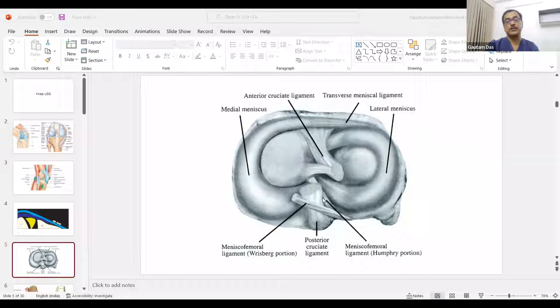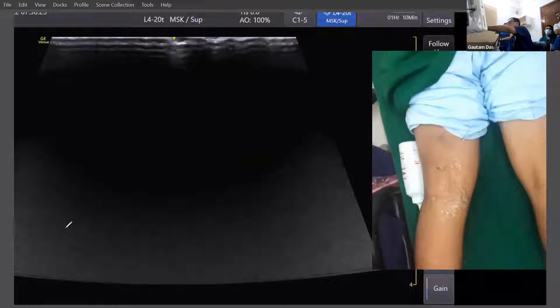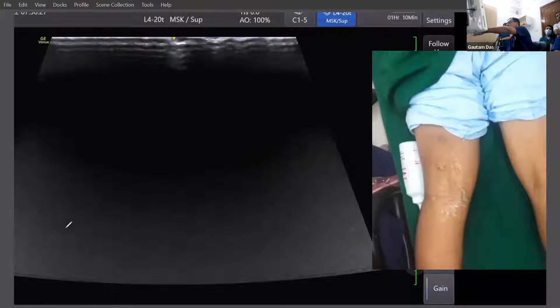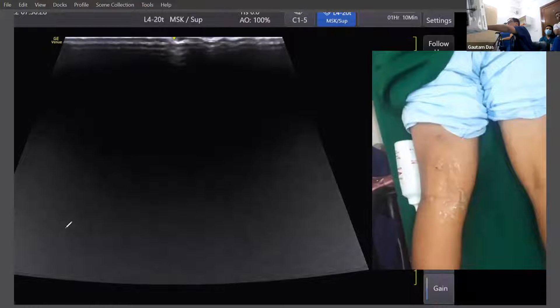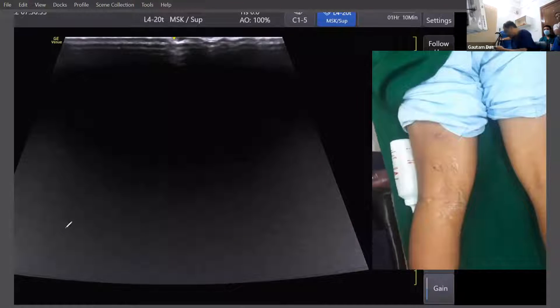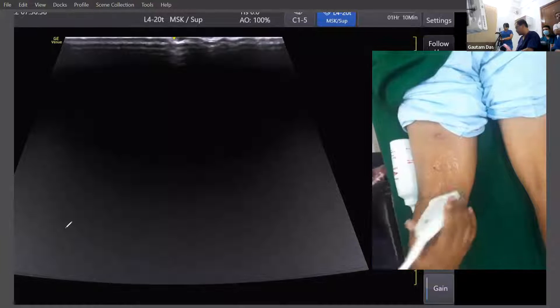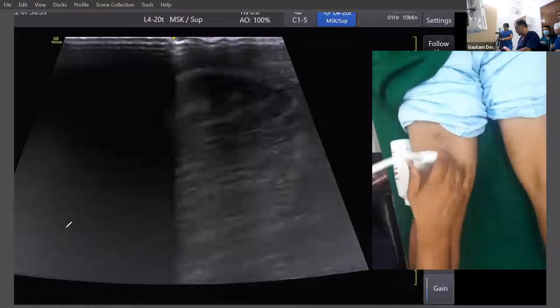The anterior portion is known as the Humphrey's portion and the posterior portion is called the Riesberg's portion. The meniscofemoral ligament starts from the lateral side and goes towards the medial side.